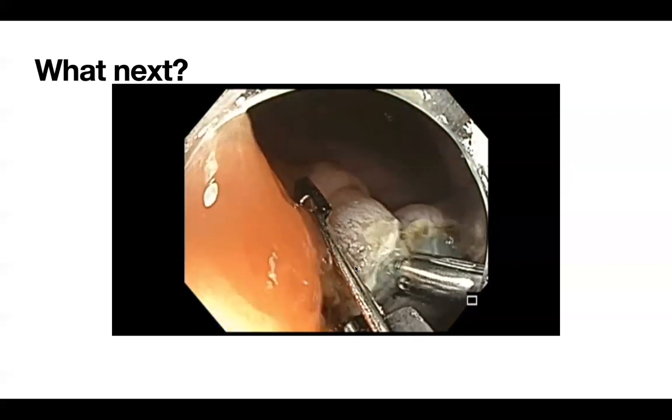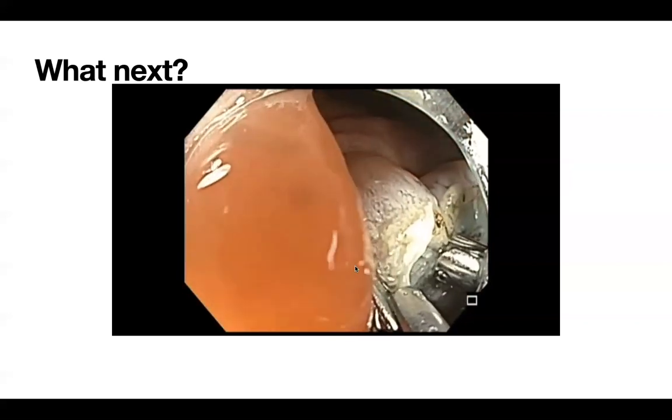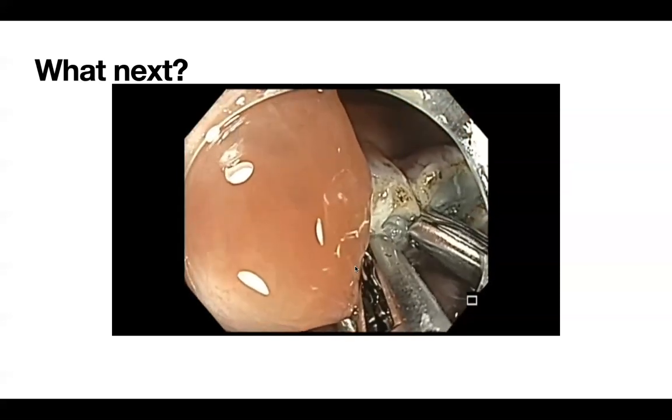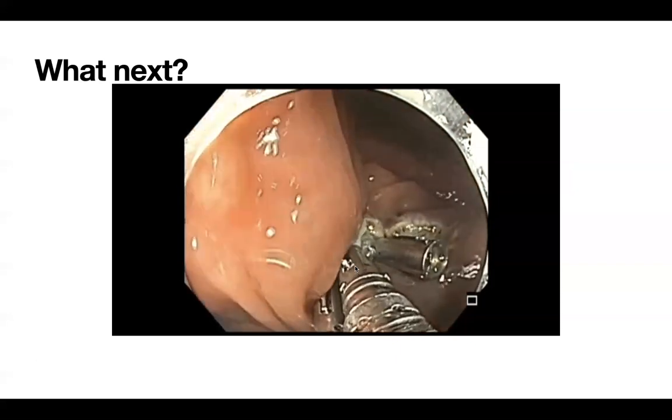The other thing is, you will notice as I'm putting this clip, I noticed a small polyp on the proximal side of the resection. And when we come to that, I will actually point it out.